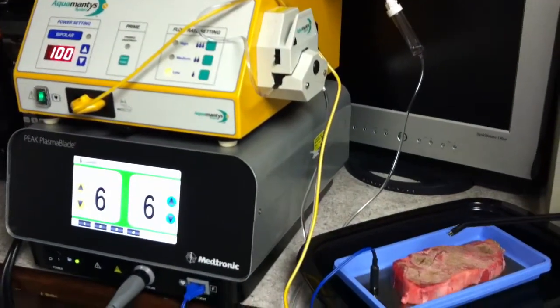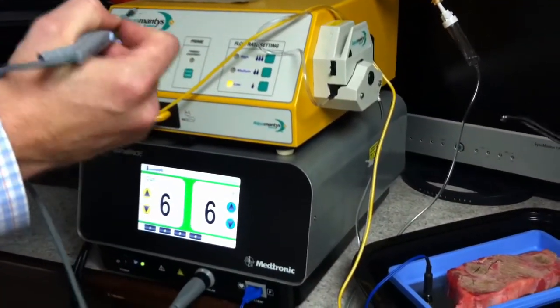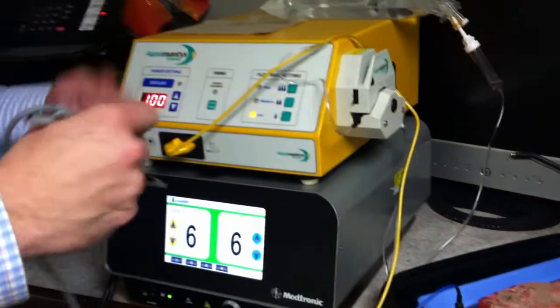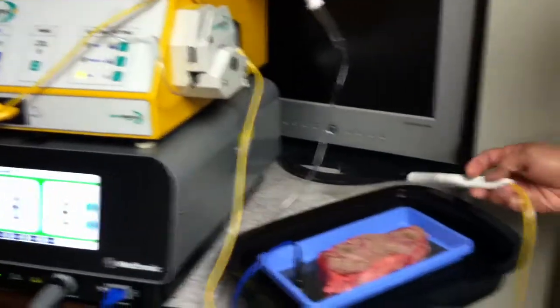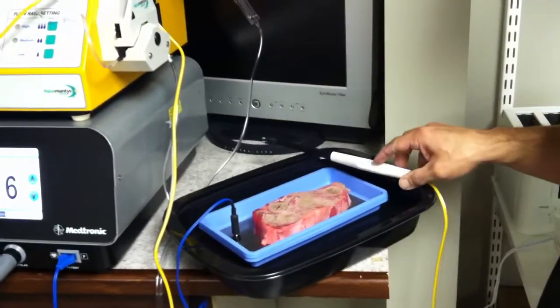Okay. Well, I was in a flap case yesterday where the doctor was working in a pool of blood, and he said, this is cool because I can spot coagulate in it. You just couldn't do that with the Bovie. Now, at Barnes, do they use both of these, or just this? They use that. I wanted to show you both just to introduce you.